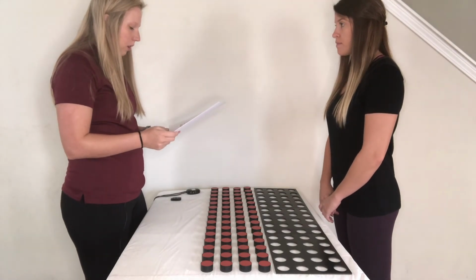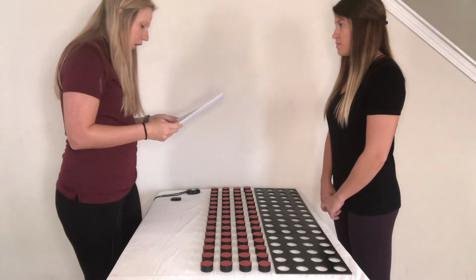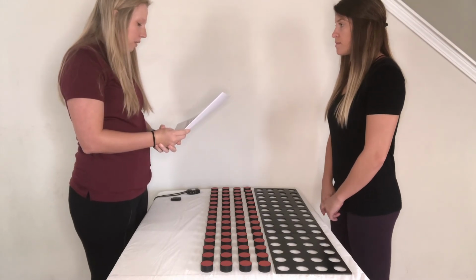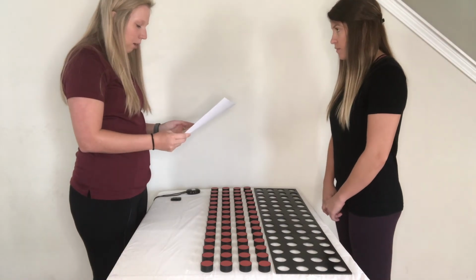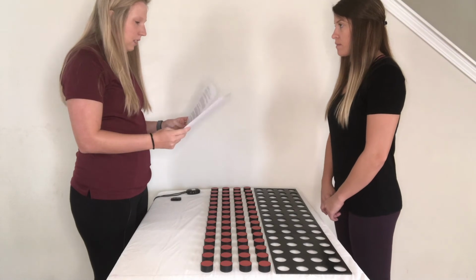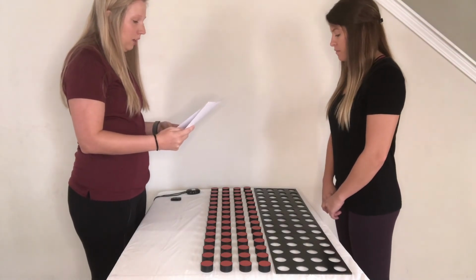Do you remember the order in which you pick up the discs and place them? Yes. You must make sure that all of the discs are fully inserted into the holes of the board before the trial is complete. If you dropped a disc, you must pick it up and insert it into the proper hole before the time is stopped. Your score will be the total number of seconds it takes to complete several trials. We will record the time for each trial separately.